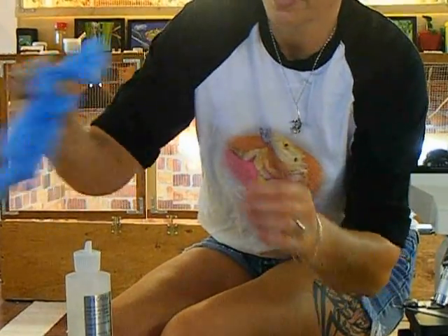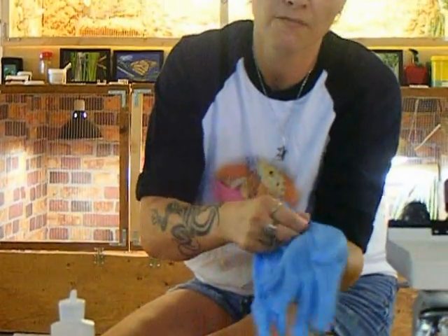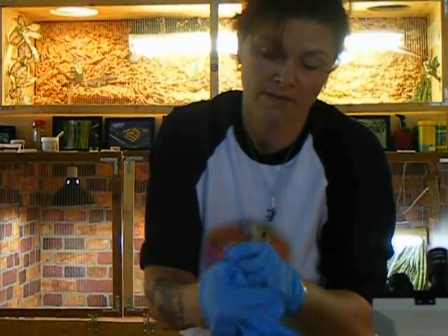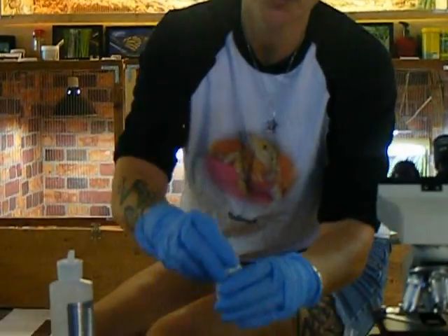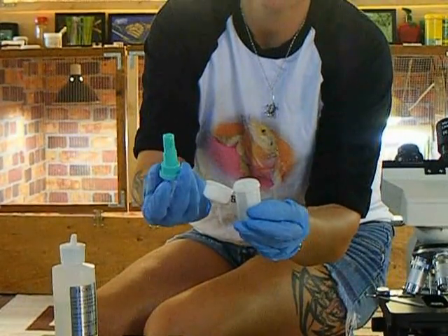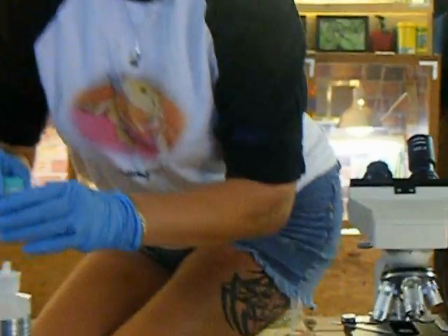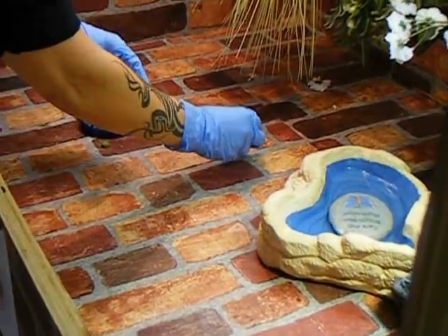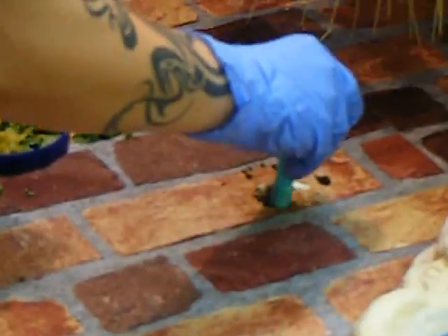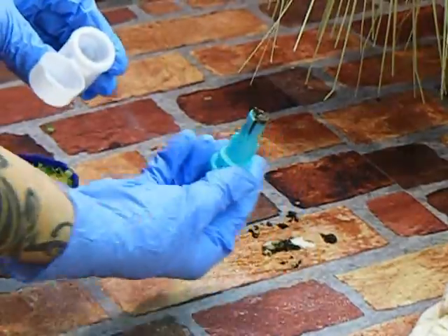So what you do is put your gloves on. You're going to get a fecal sample, and it should be less than 4 hours old — the fresher the better. You take your fecal tester, open it up, and take the green part out. Get a little bit of fecal matter, about the size of a raisin. You don't need the whole thing — just a little bit will do.